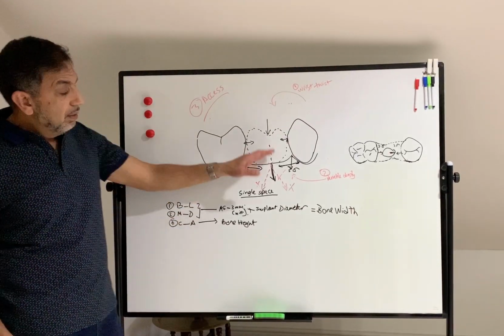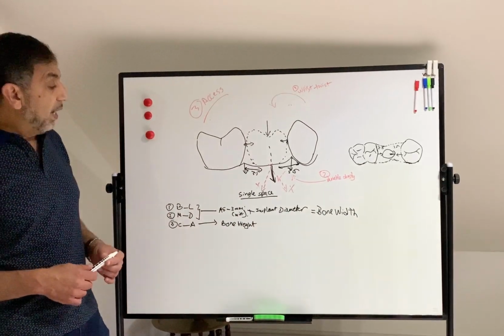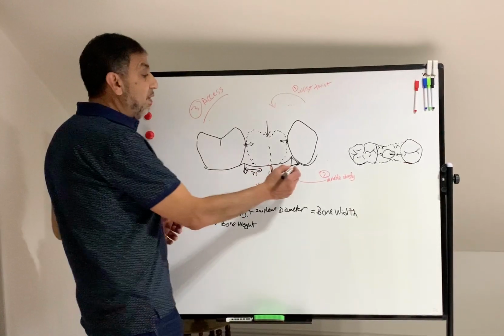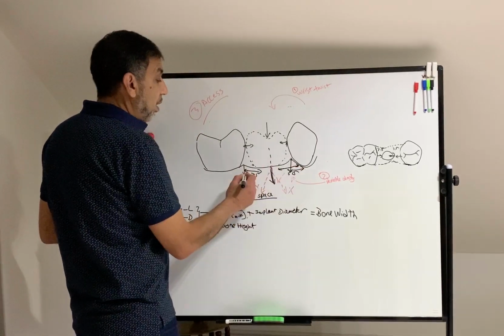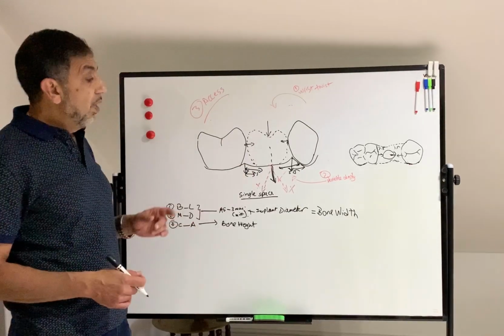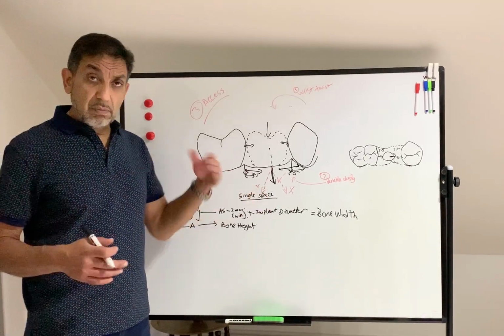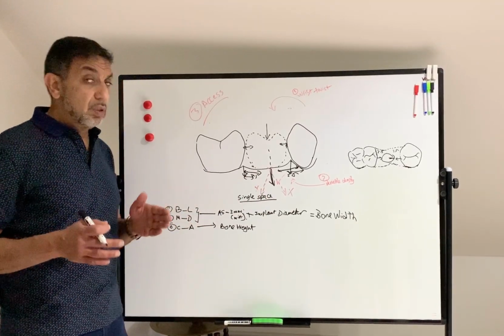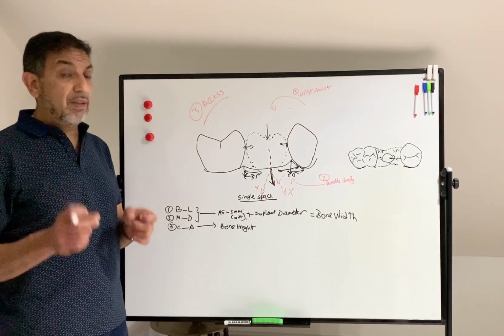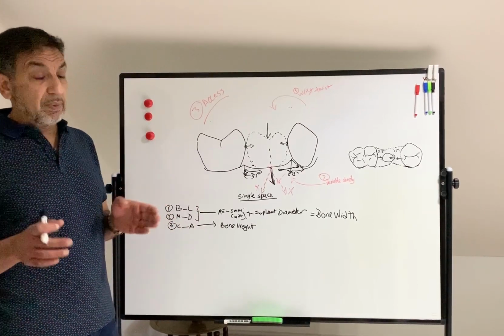Obviously, the coronoapical is the bone height. So you have to have enough bone height and you can measure the length from there. So just to sum up the rules, you have to have 1.5 millimeters of bone width between the periphery of the implant and the adjacent teeth. Buccolingually, again, 2 millimeters. Buccally, buccal bone is very, very important. And lingually or palatally, the palate is not a problem because the palatal bone is quite thick by nature.